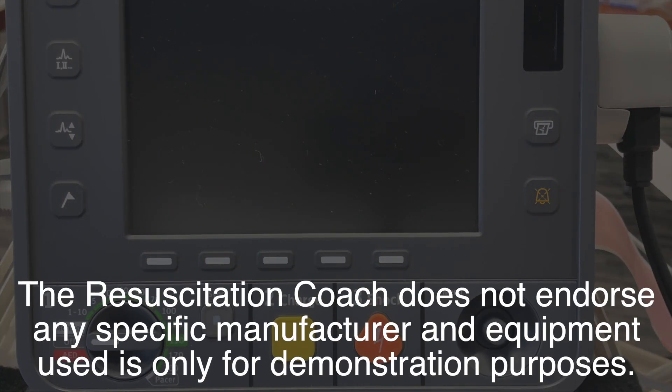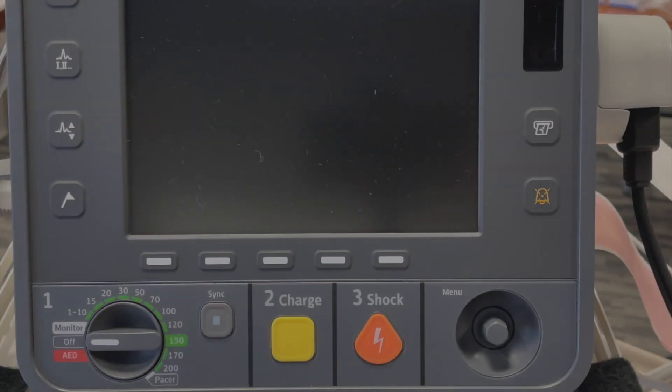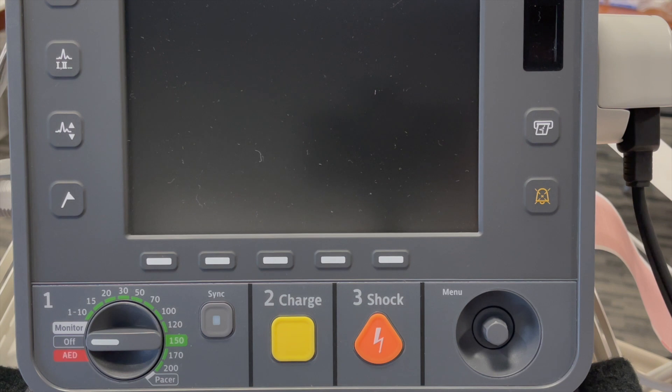As part of your checks on the Philips Intrepid defibrillator, always make sure that the check mark is blinking. If you see a cross in this area, make sure that the device is plugged in and make sure that your therapy cable is connected properly.